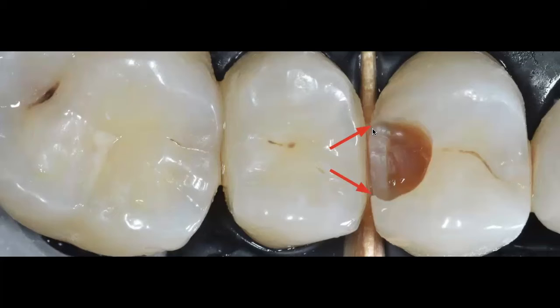And again, we all know that if we have the opportunity to bevel this enamel, we're going to be able to bond better to this outer enamel. So this outer enamel layer. So beveling this area, even including in that area the gingival floor, makes a big difference because it actually creates a 45-degree angle on the enamel prisms where you're going to have better access to the etching and better access to the bonding of that area.